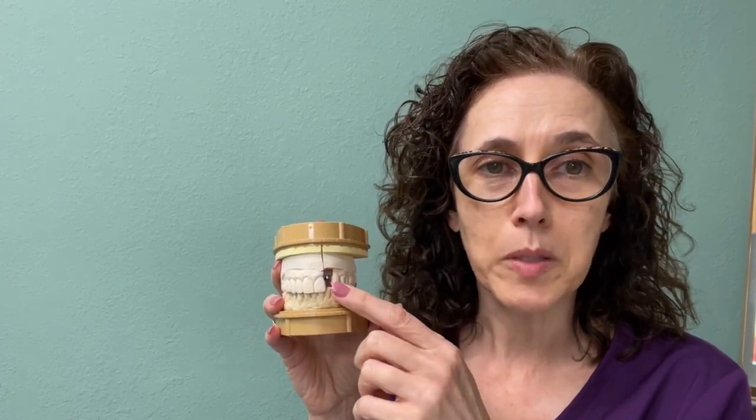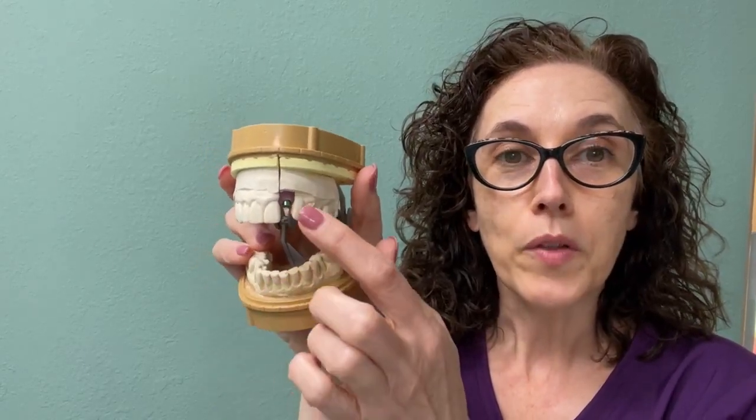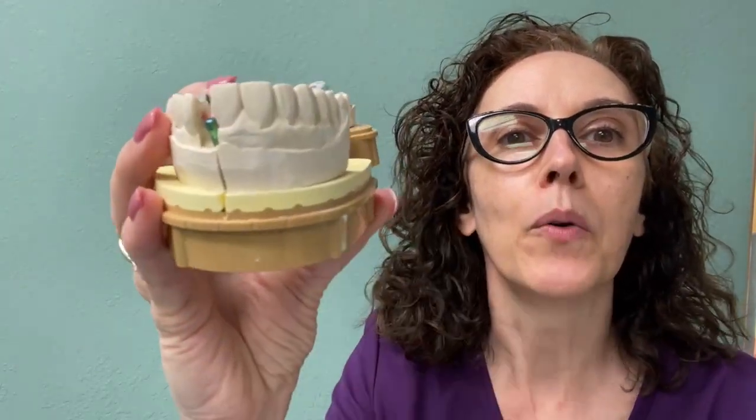So this is a cast that I have of a patient who had a tooth, unfortunately, that fractured off at the gum line. There was no way to save that, so the tooth had to be extracted and an implant was placed. So this is a model that you can see, and then there's a space there. For this example, the healing cap is already in place. But what's really neat is there's some pink tissue here that the laboratory will put on there. So I'm going to take that pink tissue off of there so that you can get a little bit of a better view. The implant itself is down, for example, in the bone there.